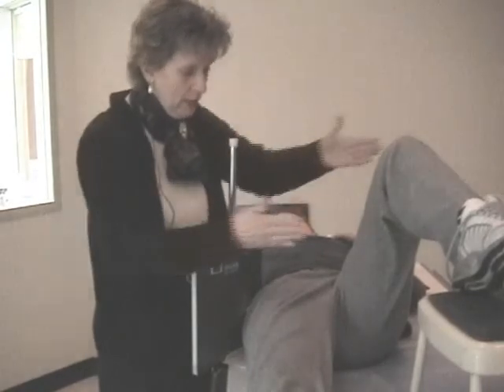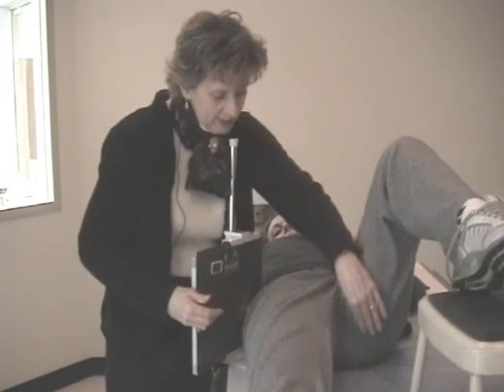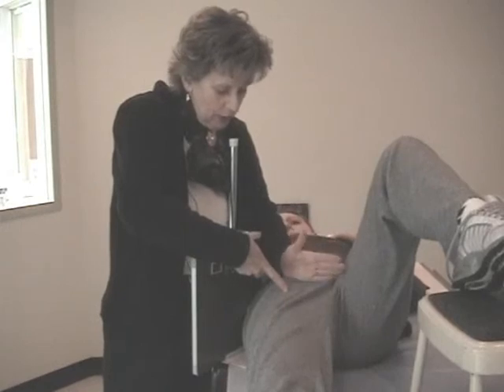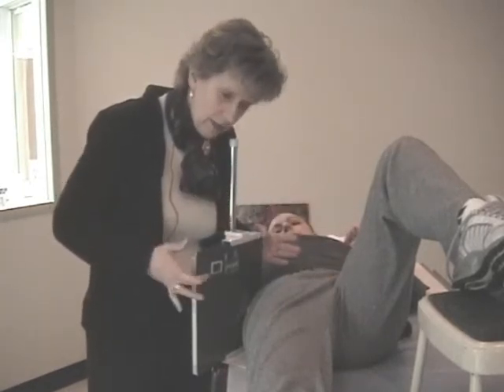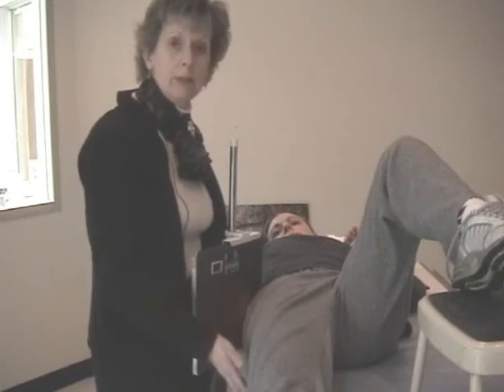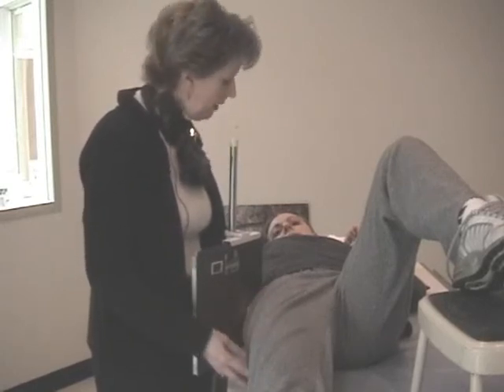I showed you the trick, how you can measure the two sides. You have the crosshair skimming the gluteal fold coming in at a point approximately 2 inches below this imaginary line, exiting to the center of the film. You collimate and you have a marker on there. And that would be your cross table lateral hip with the patient built up on the sponge, unless the patient is fairly hefty in size.